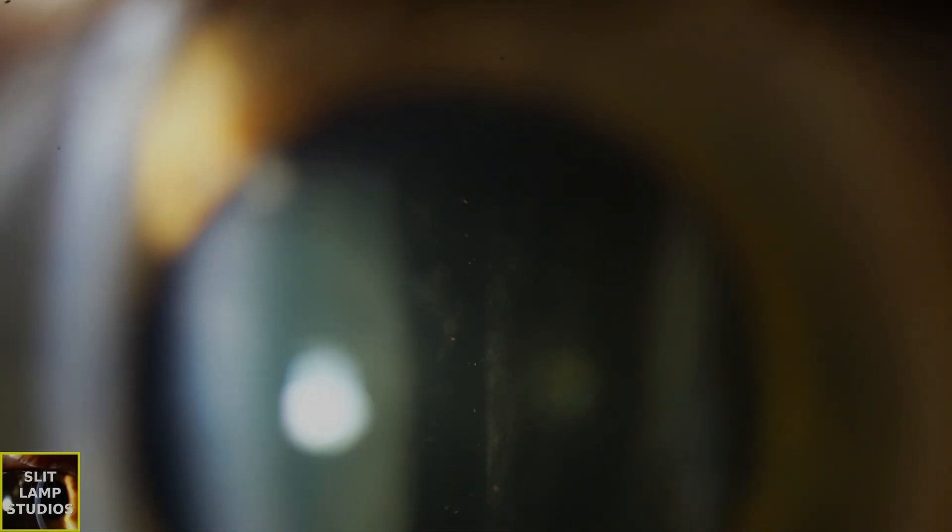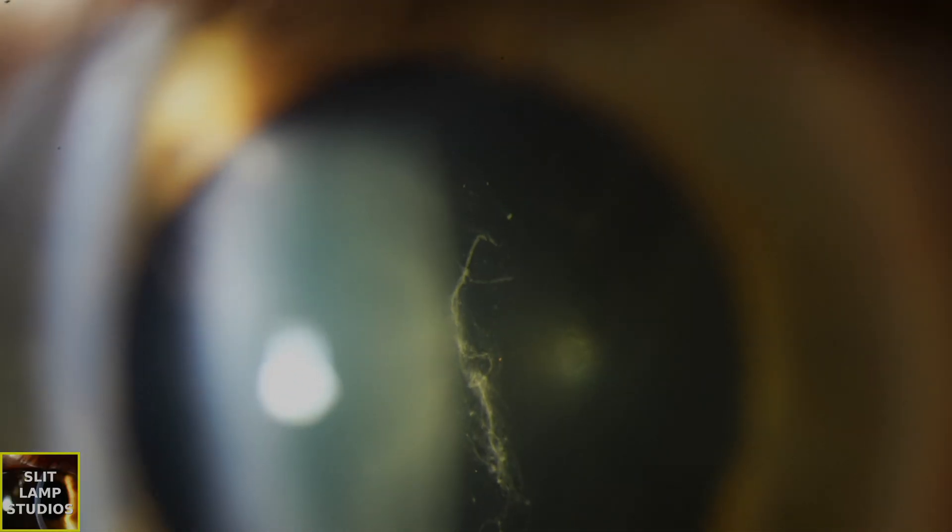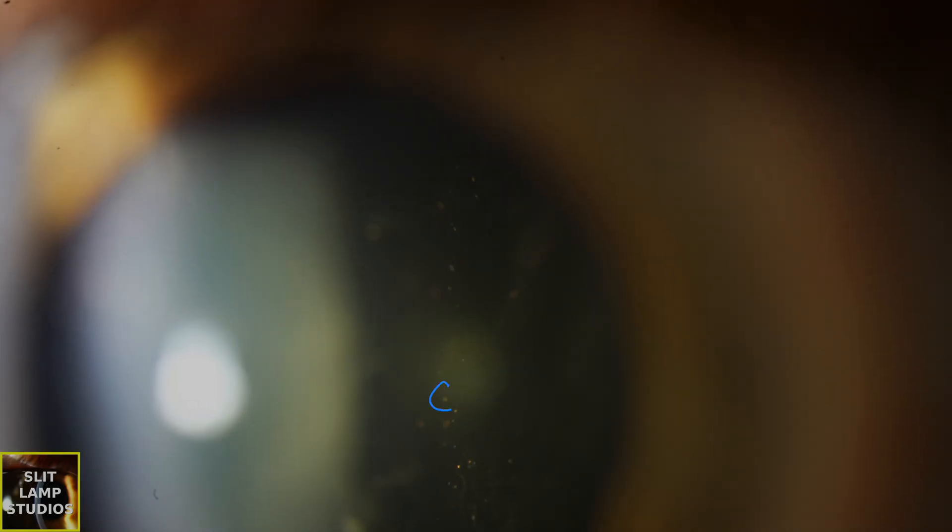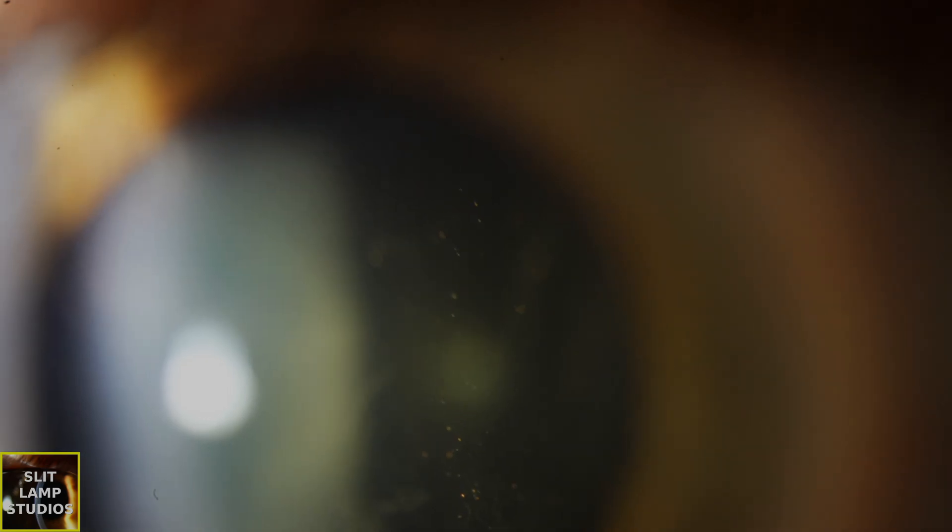Now we're agitating the vitreous. We're asking the patient to look up, down, and then straight ahead, and we can see these orange flecks. Look at these orange flecks that I'm labeling there. They're very different to cells or red blood cells. They're large, orange, and very reflective.